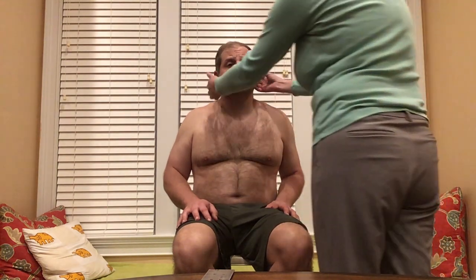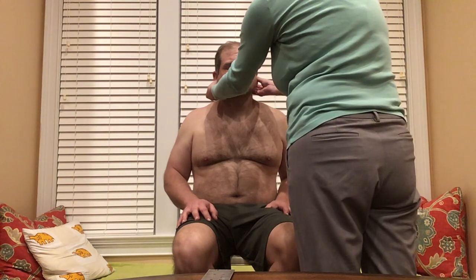Moving on to Mark's ears, I'm going to assess for shape, position, size, symmetry. I'm going to palpate the pinna and tragus for any nodules or tenderness. I'm going to use the otoscope to assess Mark's auditory canal and tympanic membrane. And we'll assess cranial nerve 8 with the whisper, the Weber, and the Rinne test.